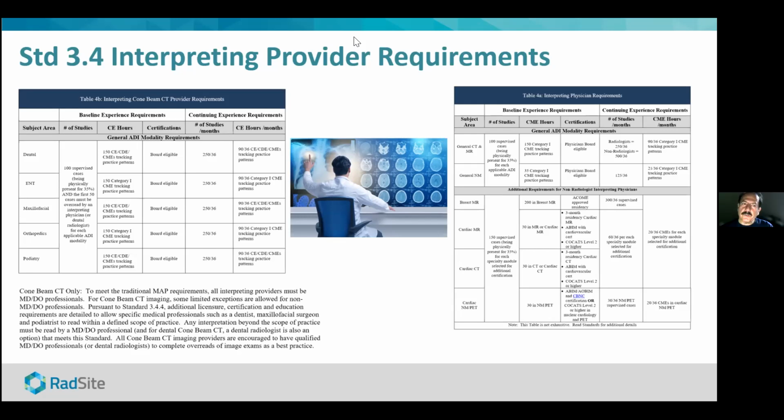Yeah, and Christine, your book is really very helpful. Radiologists in general are finding that templates are extremely important for radiology reading. Practically 100% of radiologists nowadays will dictate into a templated report, which serves as a reminder of all the different areas that you want to comment on, and that's faster. A lot of people are doing speech recognition using systems like Dragon, and others using templates specifically. I think the templates that you talk about in your book are great. And in general, CMS and other payors are used to having reports that are issued in a templated format, and I think that's something they would very much look at.